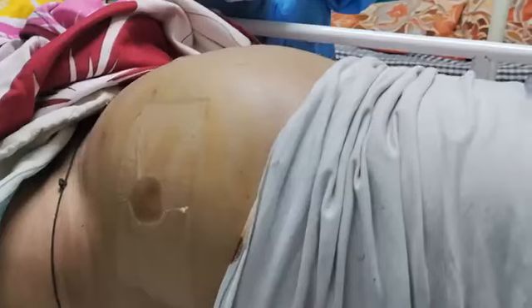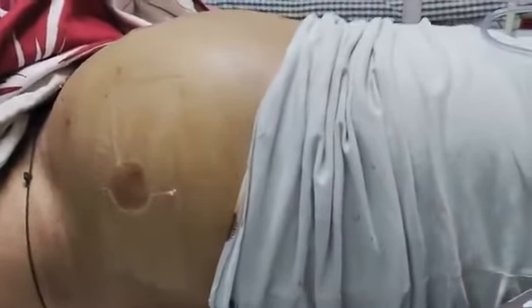Today, we are going to learn the paracentesis procedure, or tapping of ascitic fluid, in detail. Here, the patient in this scenario, a 53-year-old male, presented with complaints of abdominal distension, nausea, along with difficulty in breathing. As we can see, the patient is tachypneic with a respiratory rate of more than 24.